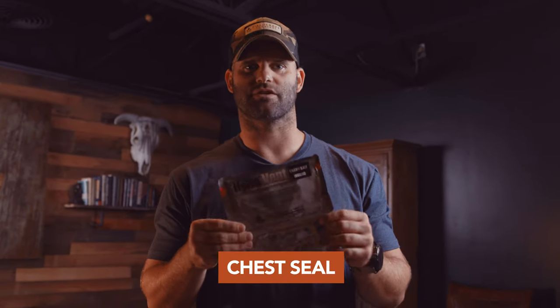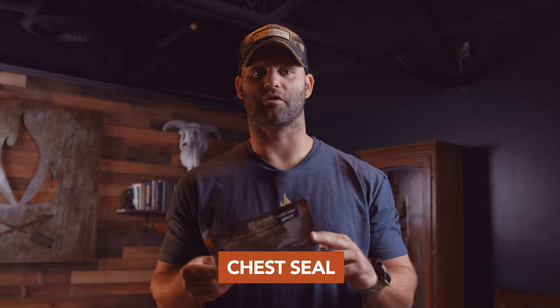The next item is a twin pack of Hyfin chest seals. Depending on what injury patterns you might have — any penetrating chest trauma, navel to neck — I've got something that I can seal the chest wall with. That way I don't have air getting inside and putting pressure on my organs inside of my chest wall.